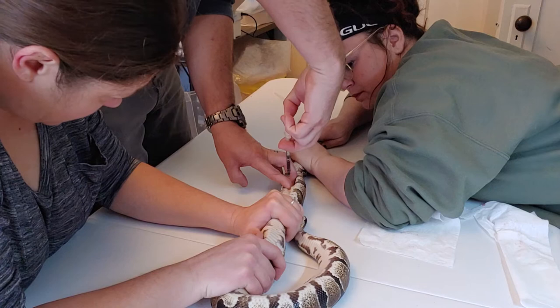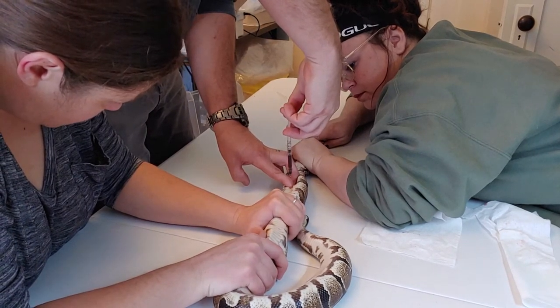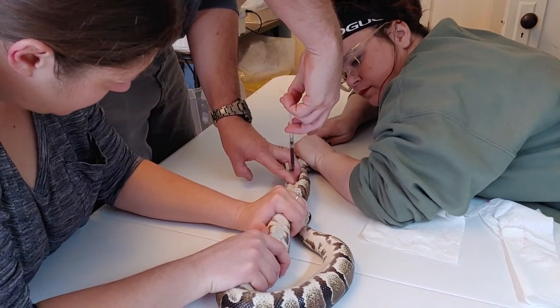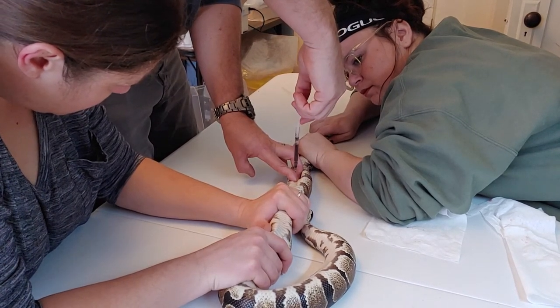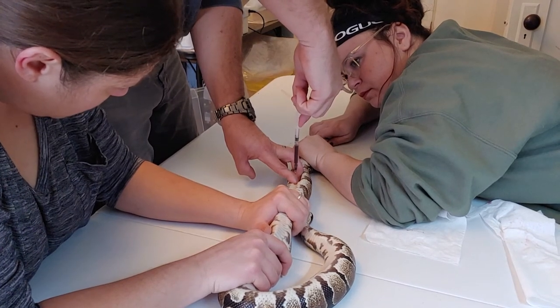Good job buddy. With a snake this cagey, my stabilizing hand — my left one — I don't have on the table. Yeah, you're okay. I'm ready to float, because he is ready to move and I gotta be ready to basically release the needle, at least my right hand. The needle will float for a minute.